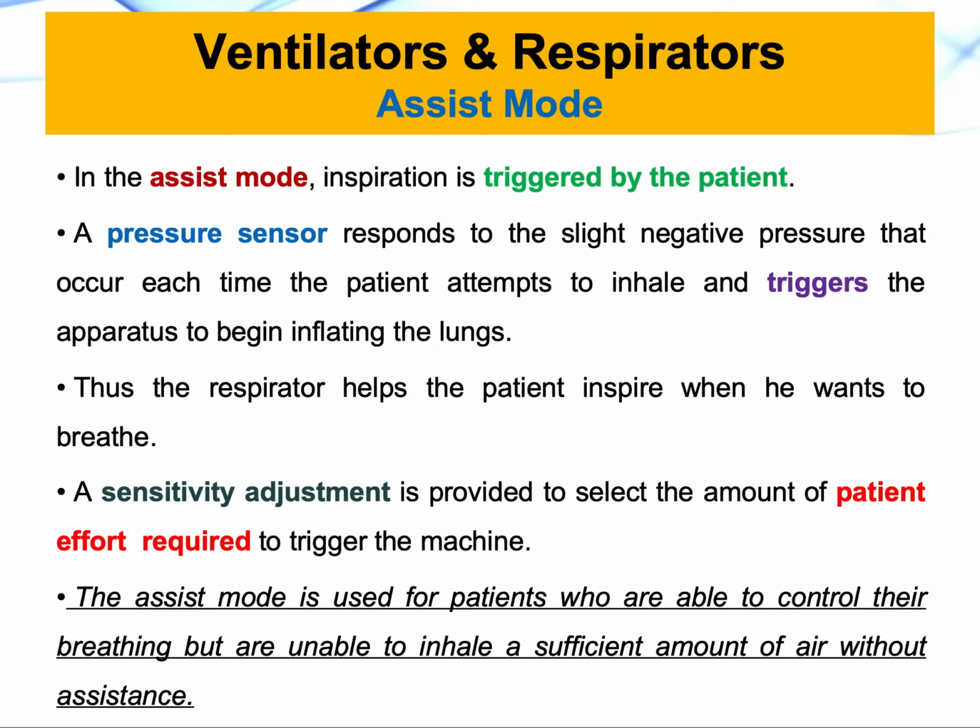We need to keep in mind that with this assist mode, we need to have a lot of other adjustments and control of the ventilator and the respirator, as we explained in the previous video when we talked about time, pressure, volume, or flow cycles.